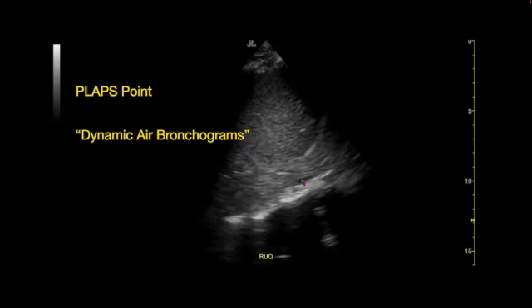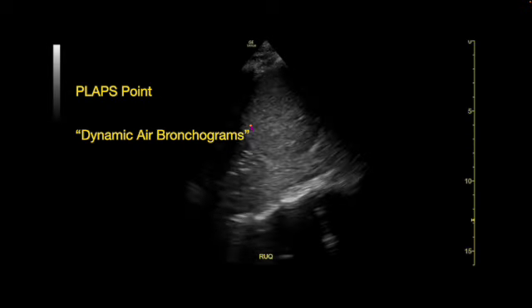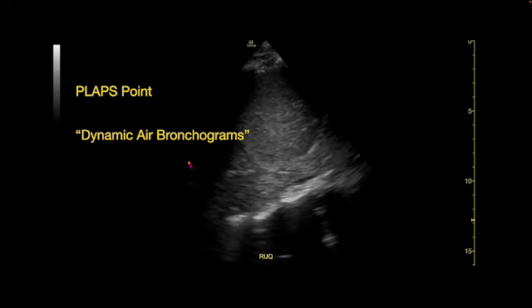Now, in this view, oftentimes we see the liver and the diaphragm, right? Again, here's the liver, and here's your diaphragm, usually in a well-aerated lung, and you see nothing behind it. When you see something behind it, that means that there's not air in there, because remember, air scatters ultrasound beams, and they just scatter into the atmosphere. They don't make it back to the probe for the machine to create an image, right? So it just looks gray.